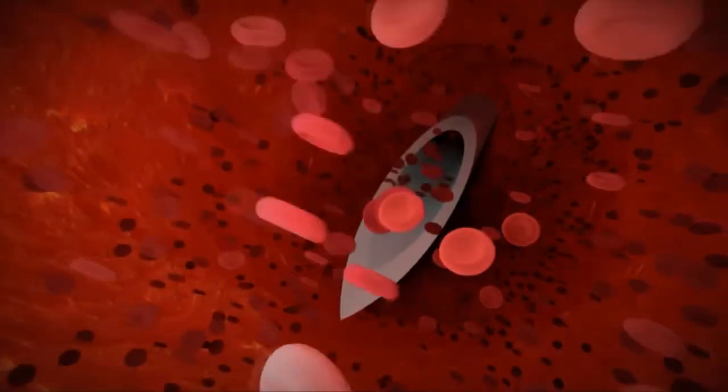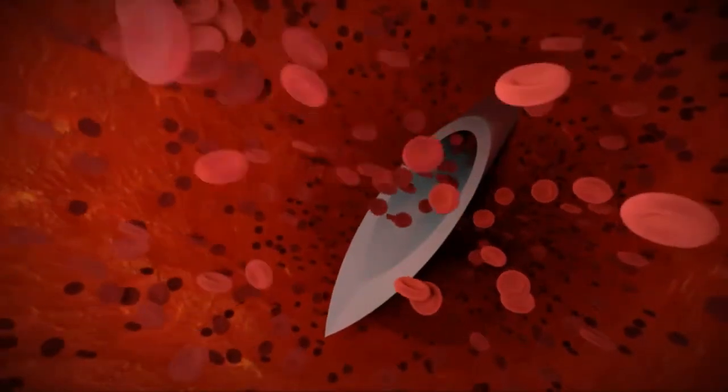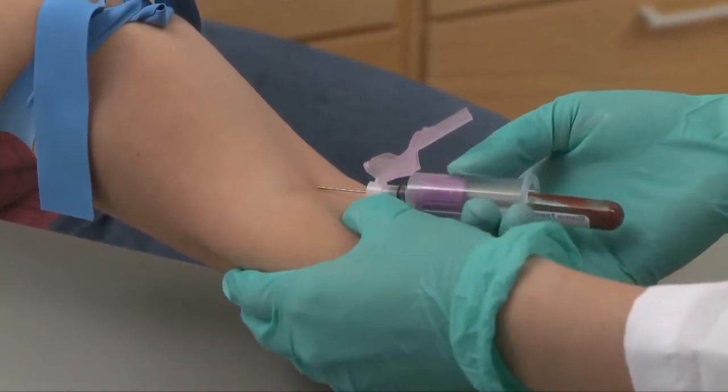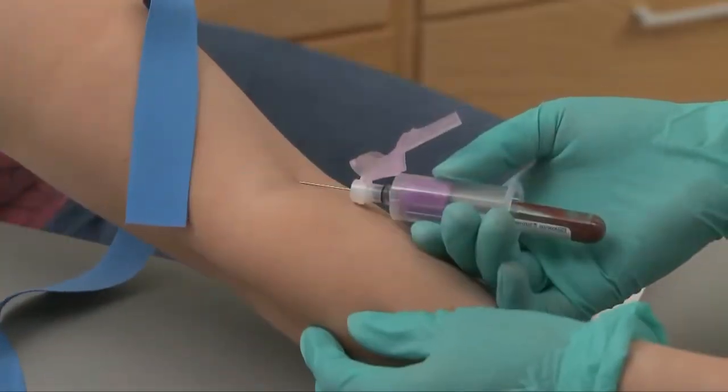The evacuated tubes are color-coded based on their additives. Know the types of additives and which color tubes are to be drawn based on requisition. As soon as blood begins to flow into the collection tube, instruct the patient to open his hand and remove the tourniquet from his arm. Removing the tourniquet allows the blood to return to its normal rate of flow through the vein and helps reduce bleeding at the puncture site.